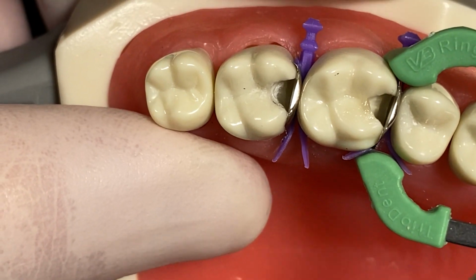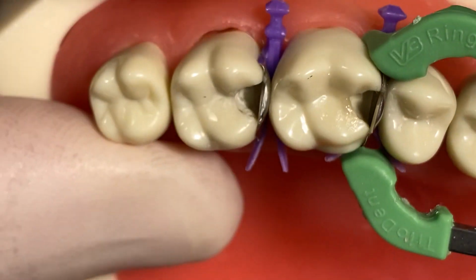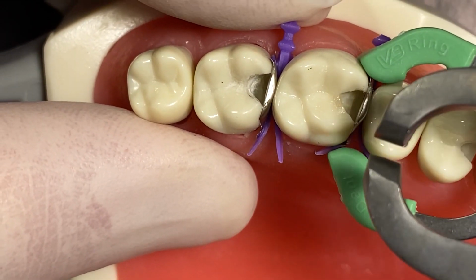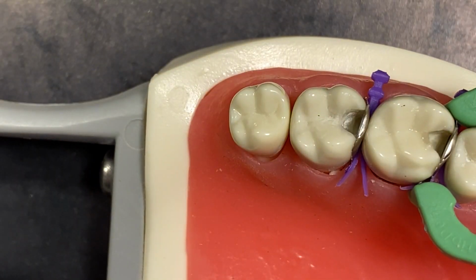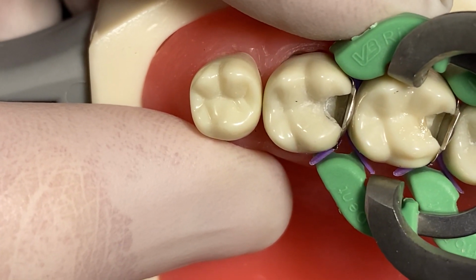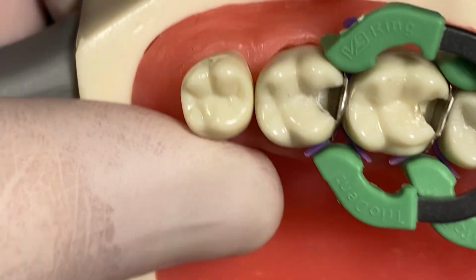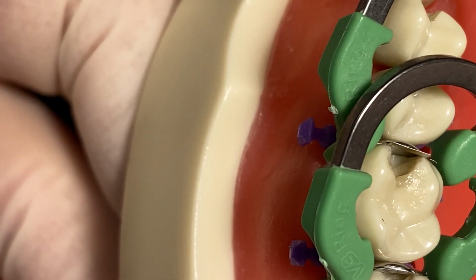So with these wedges, you just follow the leader or connect the dots. You follow the split wing and let your ring go in between those split wings of the posterior wedge. It really sets your ring right where it's supposed to go, and the ring's not wandering or floating, wondering where to go. This is a very simple, quick setup.